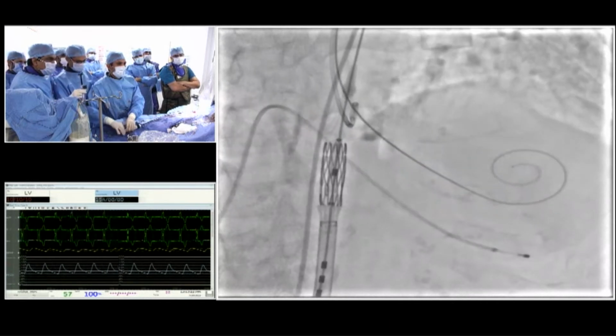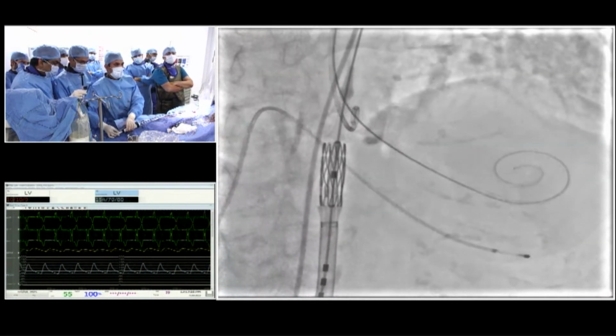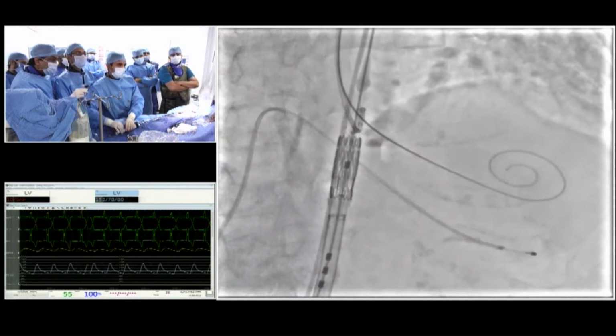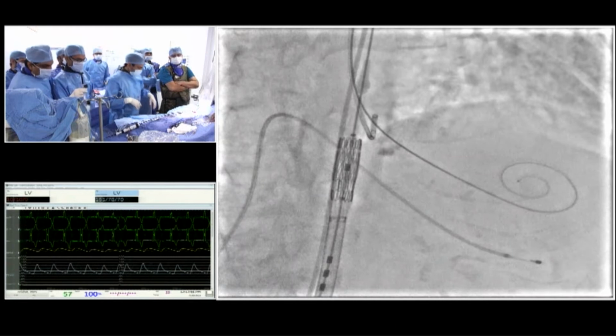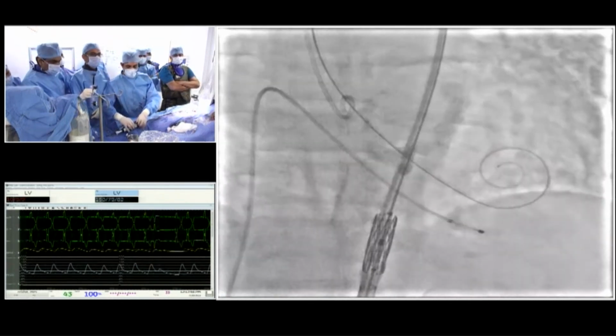I think as my valve is a little thicker French, save. But this whole thing is pre-mounted, so these steps are avoided. The only thing is the French becomes bigger, and that's difficult. Some of the newer generation Sapiens also have that ability. I think the next generation will actually be pre-mounted.